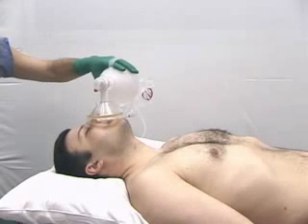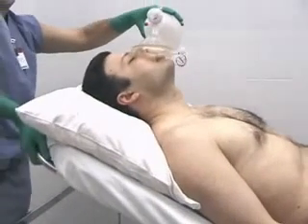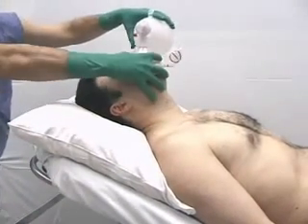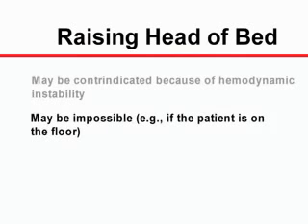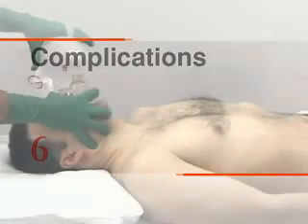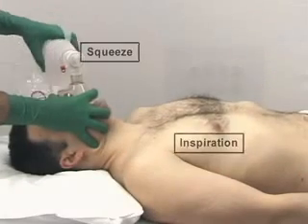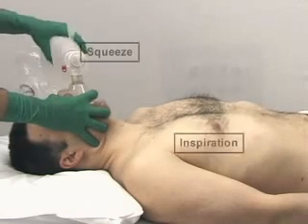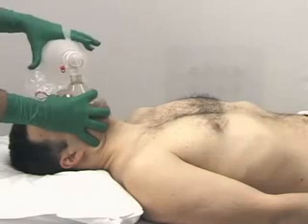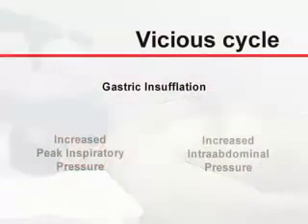Raising the head of a bed may facilitate the delivery of adequate tidal volumes, but may be contraindicated because of hemodynamic instability, or may be impossible, for example, if the patient is on the floor. When the patient is breathing spontaneously, one must synchronize the delivered tidal volume with the patient's inspiration. Regardless of the presence of spontaneous respiratory effort, when excessive pressure is delivered to the airway, gastric insufflation may occur.